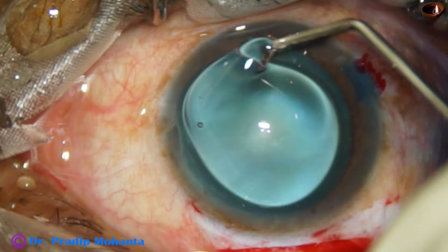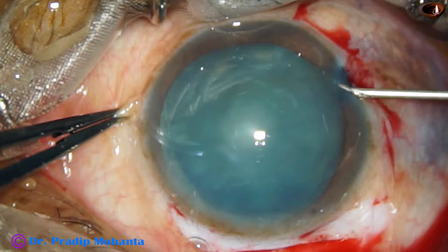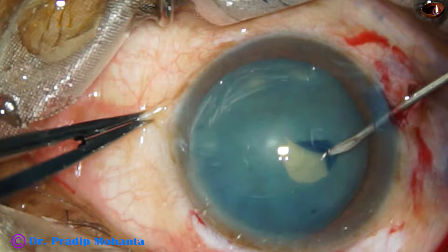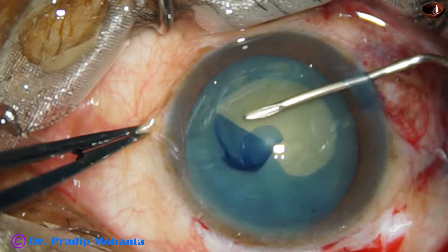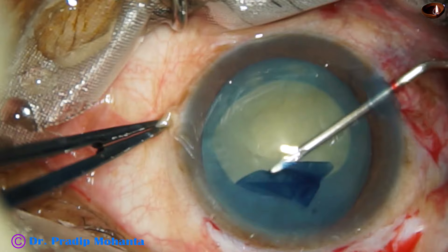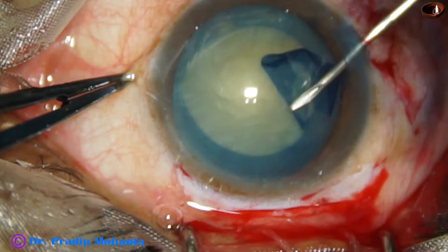Viscoelastic is injected in the anterior chamber and placed over the corneal epithelium. Now we are going to do capsulorhexis. This is a non-intumescent cataract, so we can do the rhexis with the needle very well. The capsular tag is raised and everted, and is being guided so that we get a good rhexis. At 3 o'clock, the rhexis tended to go to the periphery but we could bring it back. The rhexis is completed.